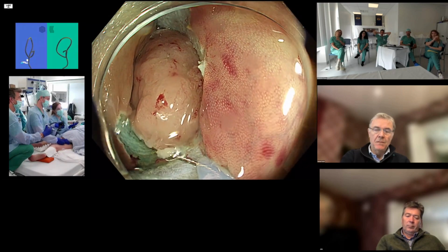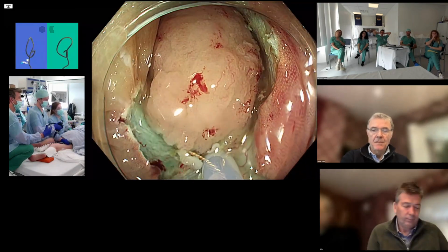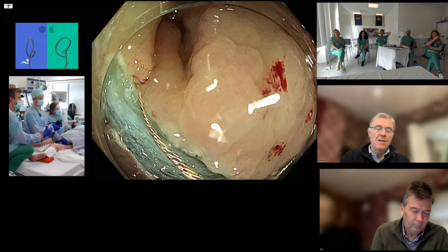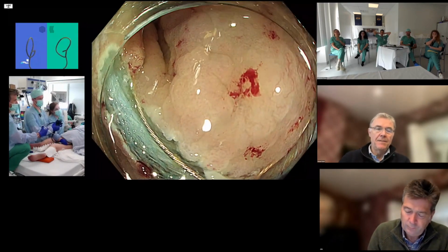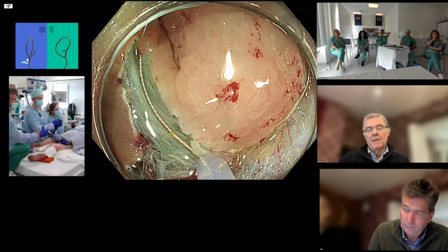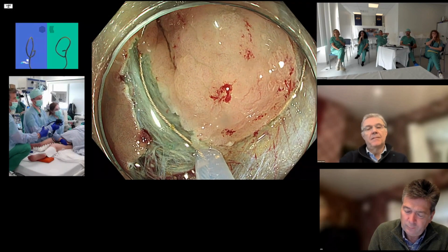Xander, you're losing the position. Your V is not in the right place anymore. So push it out a bit, push it out a bit. That's it. Right. Now the V, push it out. Good. So the V is perfect now, right? Now let the suction control it.